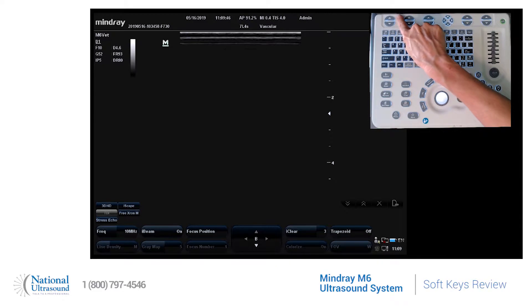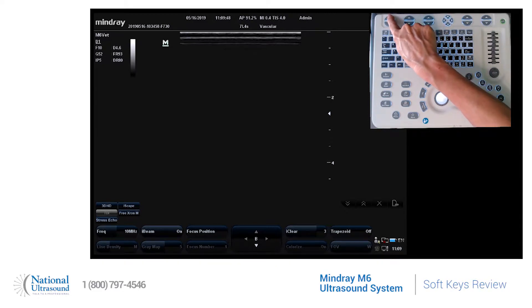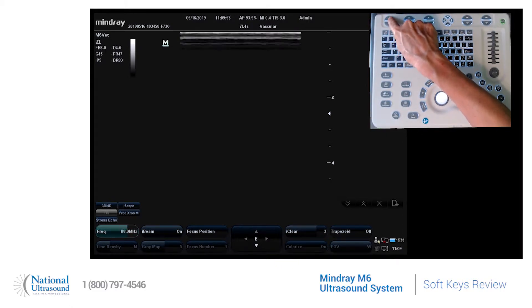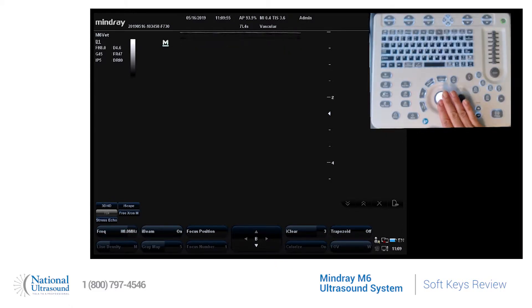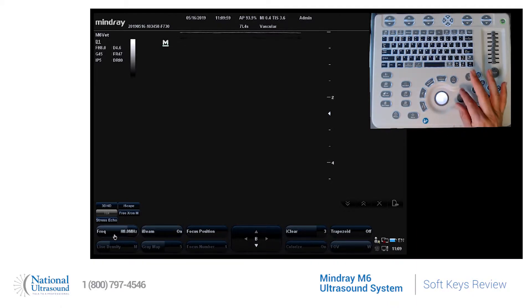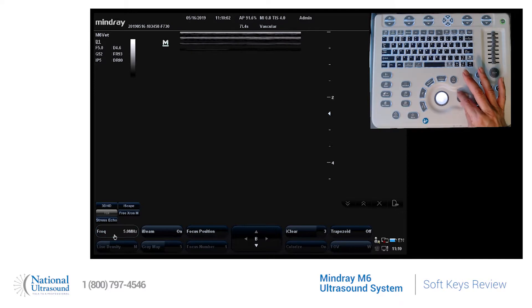So if I wanted to make an adjustment to frequency, I simply come to this button and press up or down to increase or decrease. I can also use my trackball, hover over frequency, and use this rotary knob to increase or decrease the value.